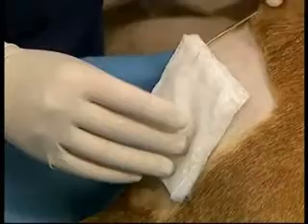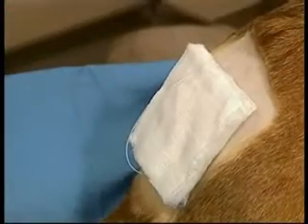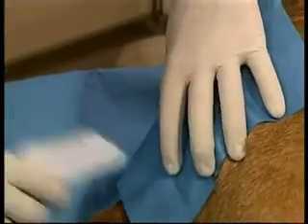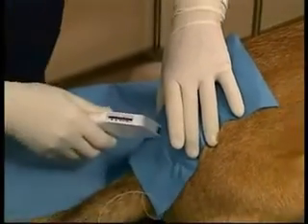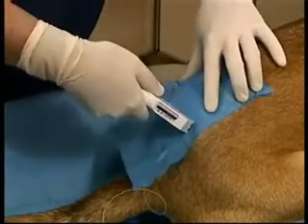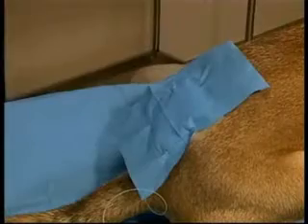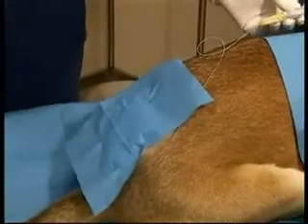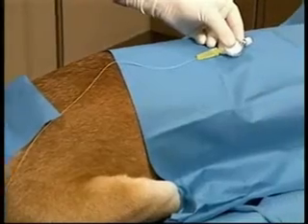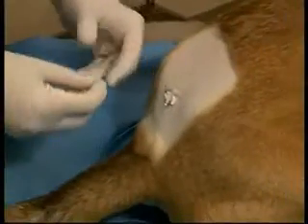Antibiotic ointment is placed over the skin entry site, followed by sterile 4x4s, and a water repellent dressing is placed on the outer edges. This can be stapled in place if this patient is going to surgery as a temporary dressing, and then once surgery is completed, this dressing will be changed since it frequently gets wet with irrigation. The catheter can be passed cranially so that the anesthetist is able to give additional drugs during the surgery.